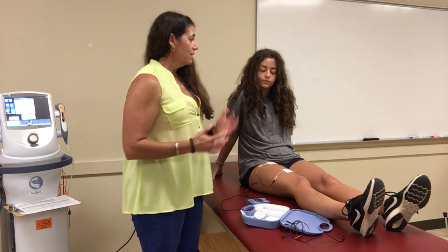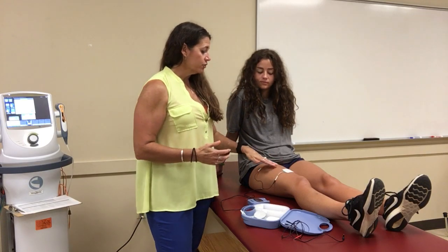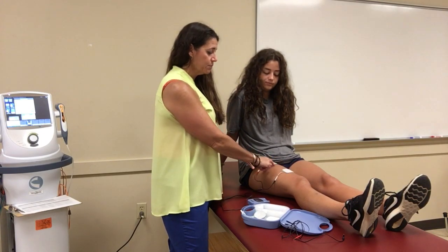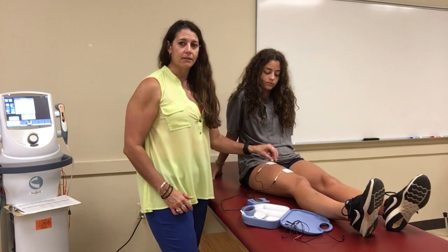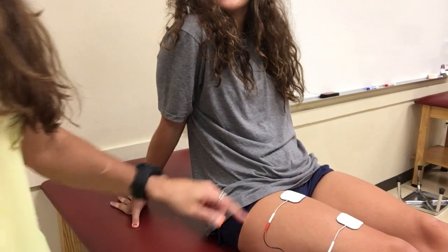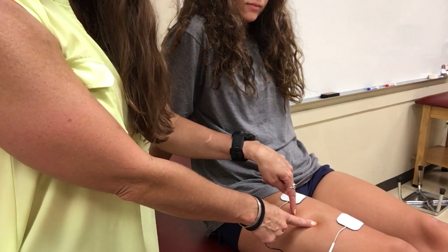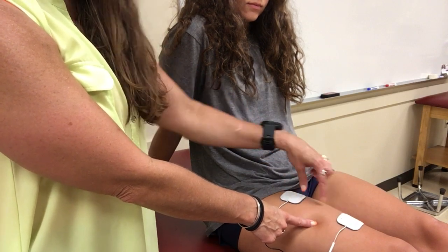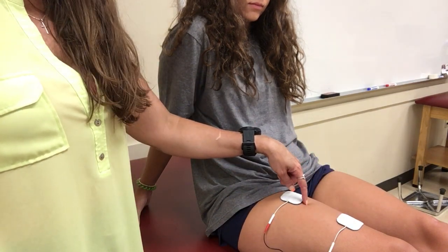The next thing is to explain to your patient what they should be feeling. First, verify that where they're experiencing pain is in the middle of the electrode placement — they'll feel it underneath the electrodes, but they should also feel it throughout the middle of that area. If the electrodes are here but her pain is really over there, we need to move the electrodes so that the pain is centered between them. Where you place the electrodes is really important — they need to encompass where the painful area is.